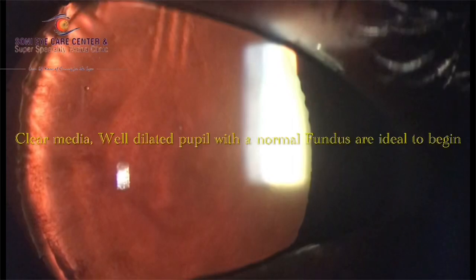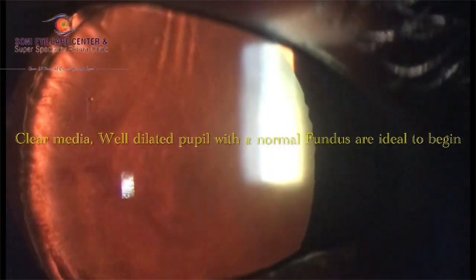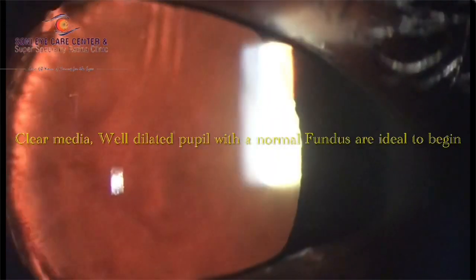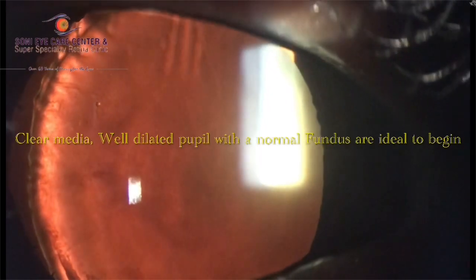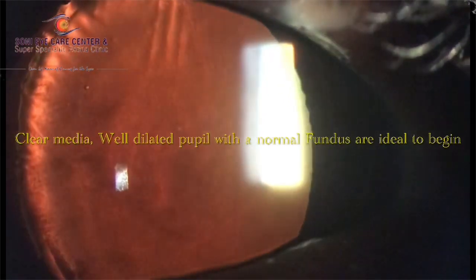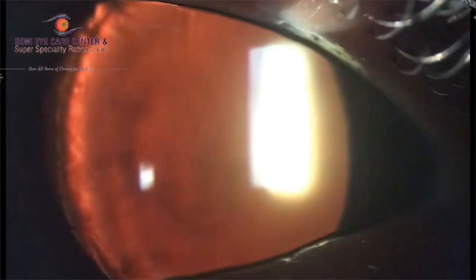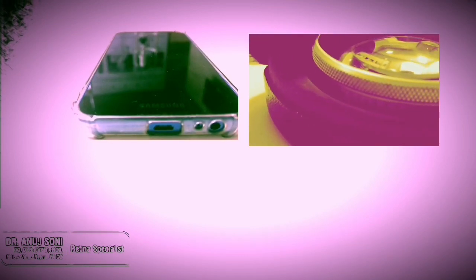Fully dilated pupil with clear media and even a normal fundus are ideal to begin with. You don't necessarily need zonular dialysis, as in this case. All you need is a mobile phone and the 20D lens.